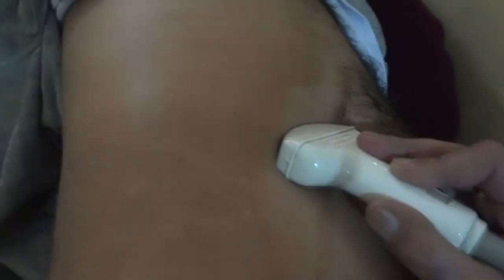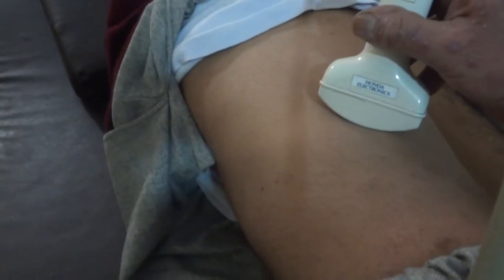Then this is one view in which you place the probe in the subcostal region, give some pressure, angle it cephaloid, and ask the patient to take a deep breath so that you can see all of the liver parenchyma with the diaphragm. Then this is another view. You place the probe in the subcostal region and move it downwards. This will clear you if there is any fluid above the diaphragm or any pleural effusion.